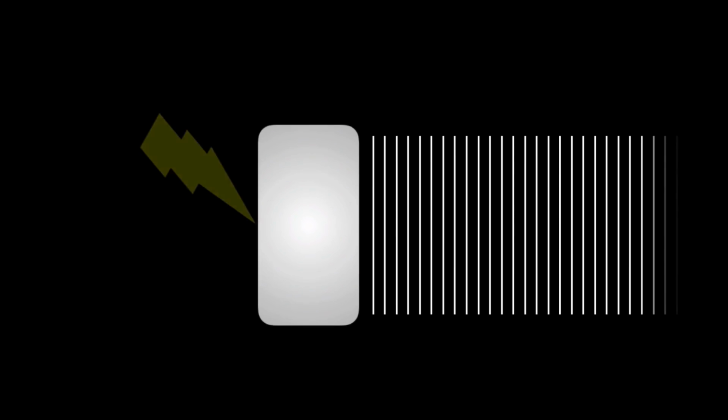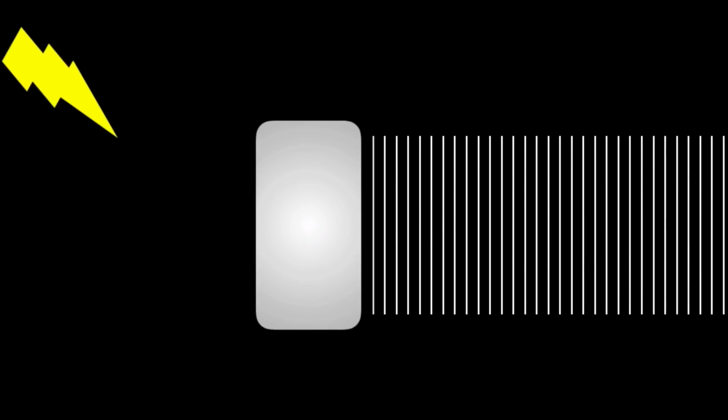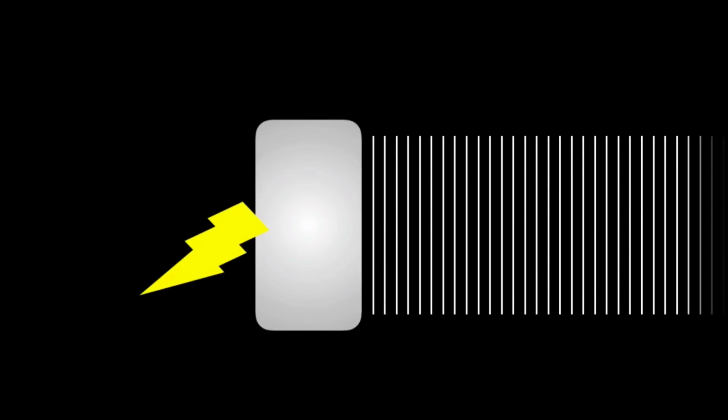Let's discuss some basic echo principles and topics related to ultrasound. The first is the reverse piezoelectric effect. What happens is when charge is applied to a piezoelectric substance, it vibrates and creates a pressure mechanical wave. The reverse, or the piezoelectric effect, is when that pressure wave stimulates the crystal and the crystal produces an electronic effect. And this is how ultrasound is produced from your transducers.